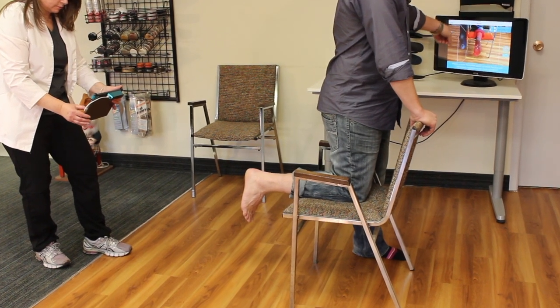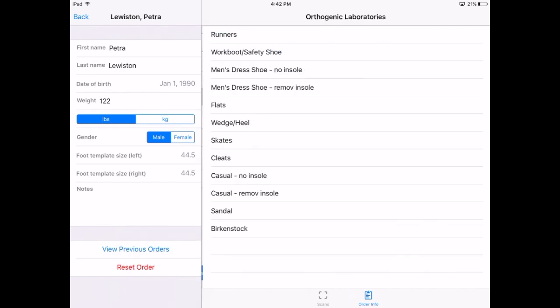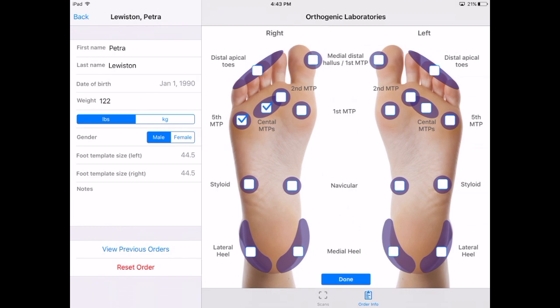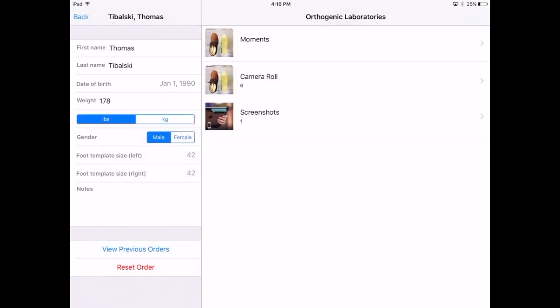3D scanning has never been easier or more engaging for patients. It will dramatically change the way clinics cast and dispense orthotics. Prescribing your custom orthotics is just as easy — every detail has been thoroughly designed by certified pedorthists to create an unparalleled user experience.